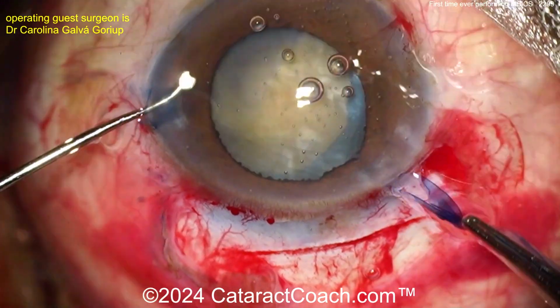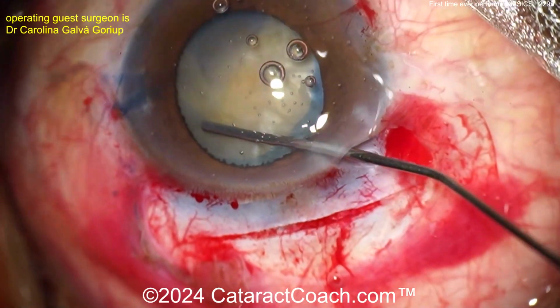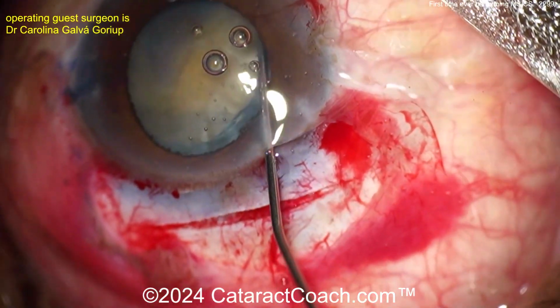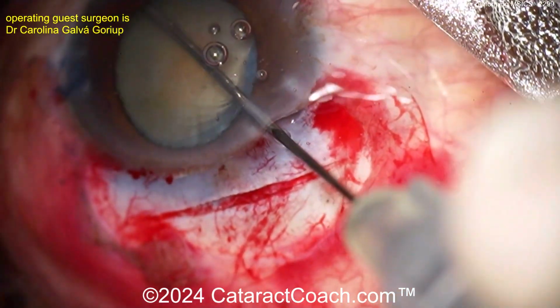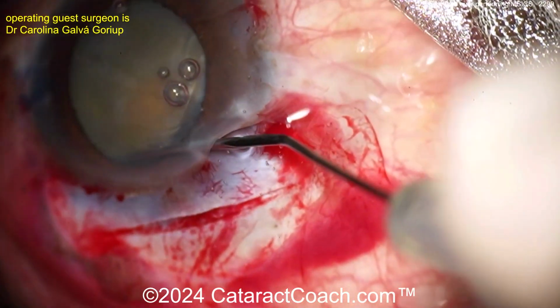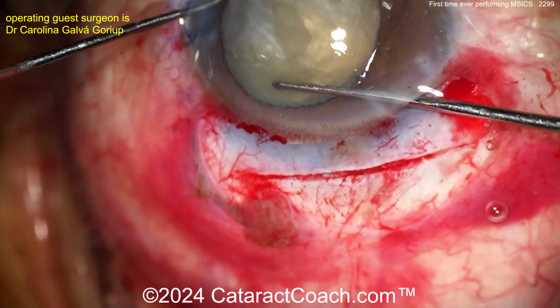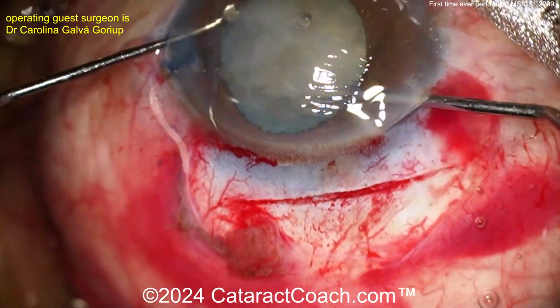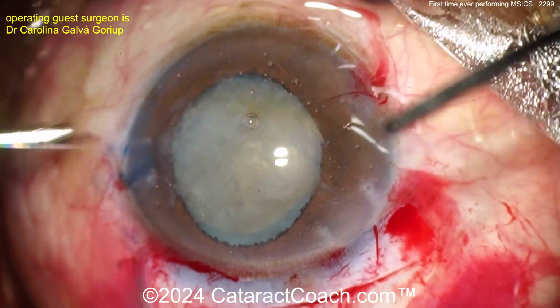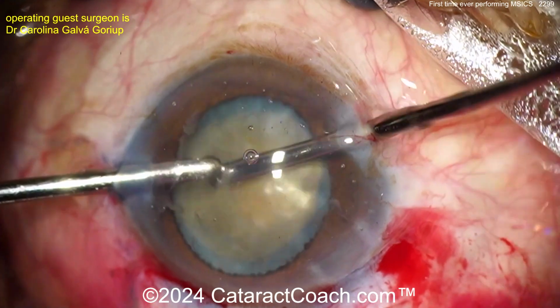And now that you have a big rhexis, you got to get the nucleus up out of the bag. And I like to even get it on top of the iris. So a little bit of hydrodissection here. Just be gentle. And then you want to get that nucleus freed up, at least get it rotating so we can get it out of the bag. Now, here we go, using a chopper or Sinskey hook in one hand and some sort of spatula in the other, kind of dialing this baby up. Look at that. There we go. Bimanual IA just to get some of the fluffy stuff out.